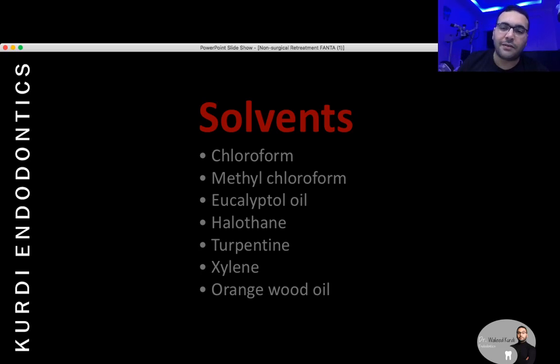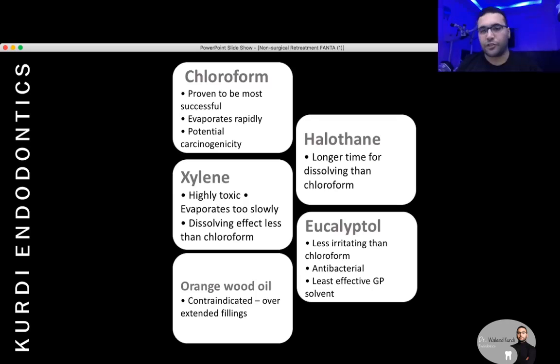First, because it makes a very bad mess under magnification and you see nothing inside the canal, and also because it goes inside the dentinal tubules and then it hinders the irrigation, and after that the obturation.